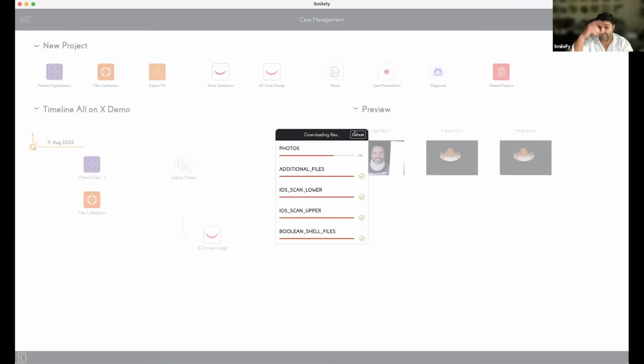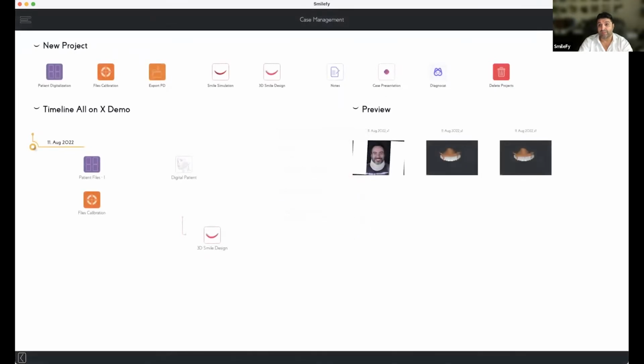Good. So that's the first step, right? That's the first step for all this stuff. Now, if we want to plan something more, or let me ask you, do you have a question so far?